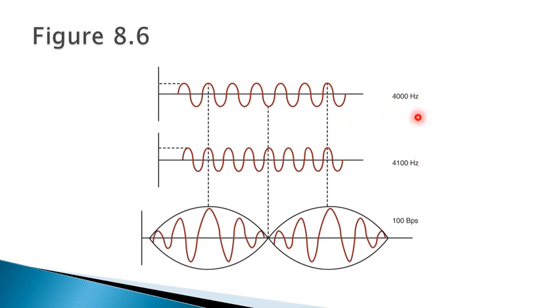You see these are your two carrier frequencies here. When you run these two carrier frequencies, you end up getting your resultant beat frequency here. This is what creates that medium frequency current where you get a little bit deeper penetration as far as the stim is concerned. It also tends to be a little bit more comfortable. But that's what you get with interferential. So you need the two channels in order to do that. You get that constructive interference effect, and that's the resultant effect of stim with the interferential current.